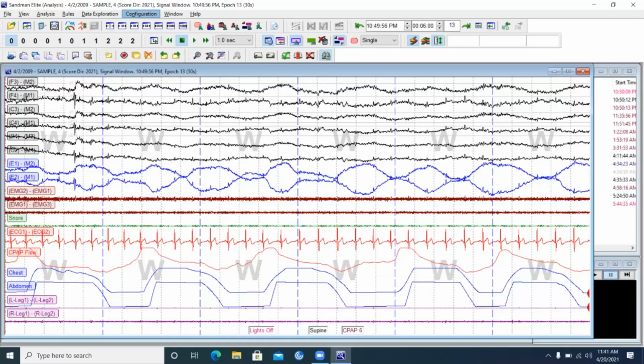On the bed 2 and 3 computers, they're like little buttons. You guys know how to get to the impedance test by this point. The amplifier calibration is the button right next to it, and then the biocals is just a drop down. So as you say it, you can click it. It's just a matter of learning how, and we'll show you how to use the intercoms too, so you can talk through it.